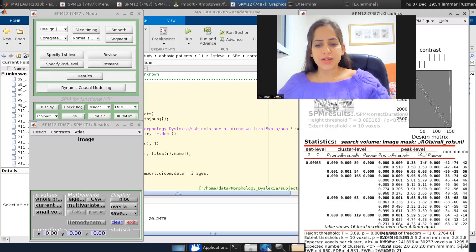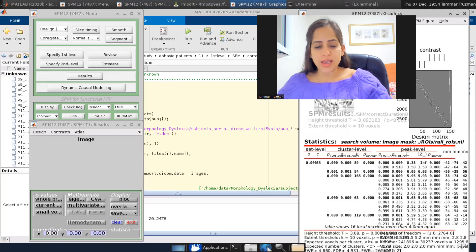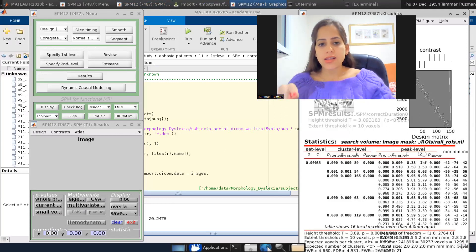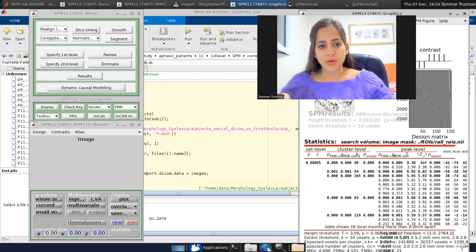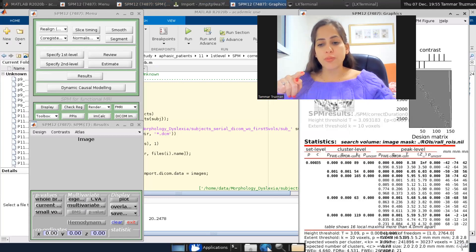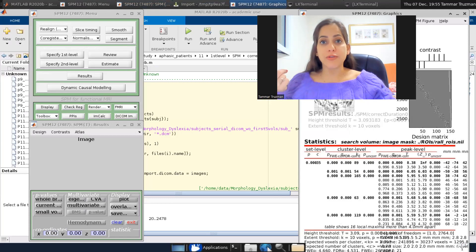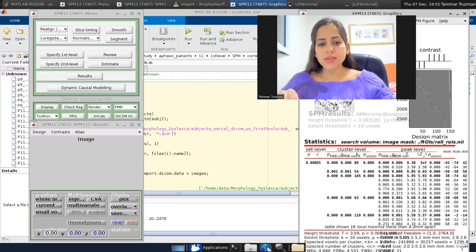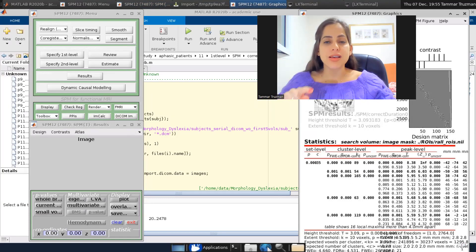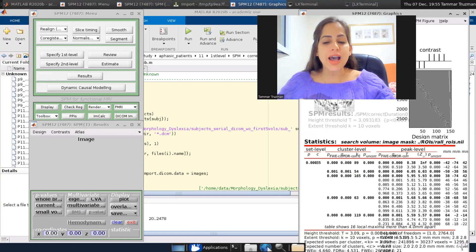what I get here at the bottom of the table, family-wise error p for our volume of interest, the family-wise error corrected p value of 0.05, which is the default, corresponds to a high threshold of T equals 4.66. This is what it means.